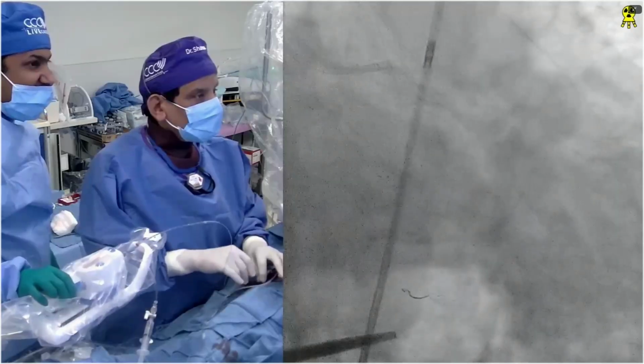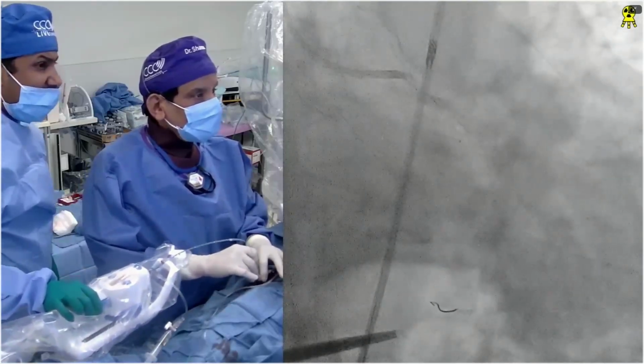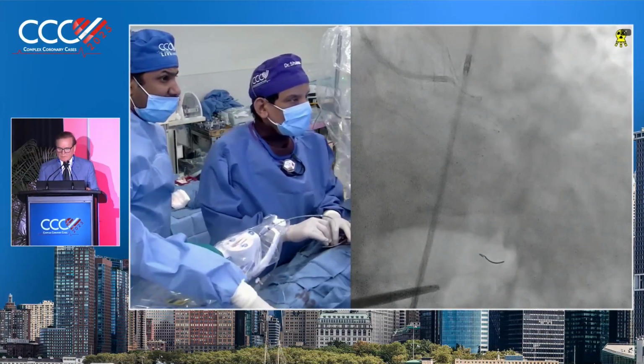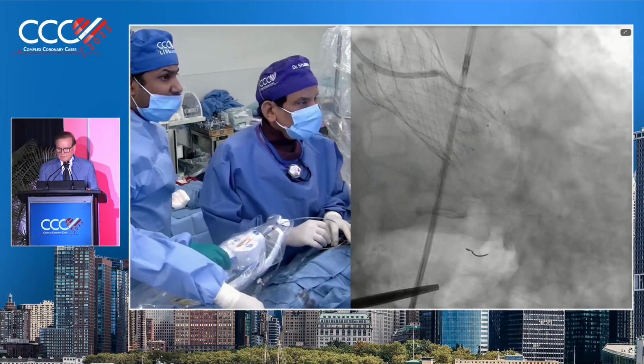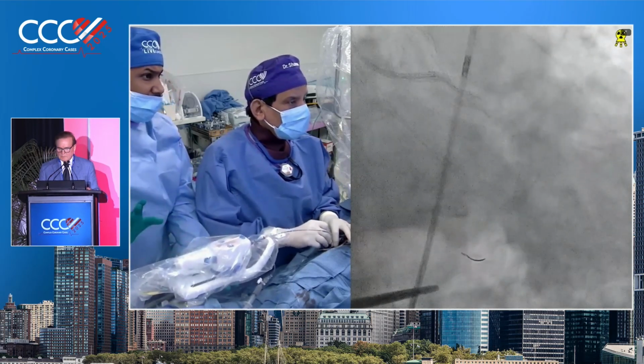So the IVUS shows like an 8. It's oblique. Except the area for the left main is very good. And now let's say, where is the wire going? This one going. Yeah, good. So we are there. I don't want to bring back my GuideLiner.